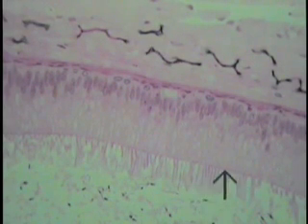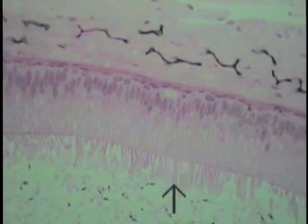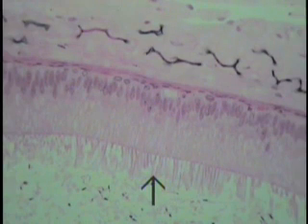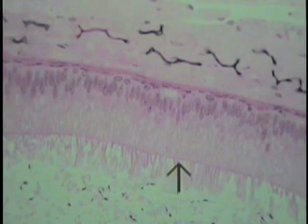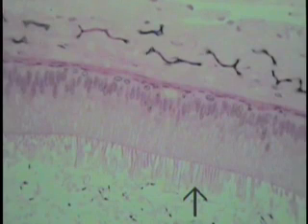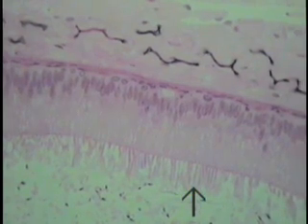These are oftentimes clumped together and form these wisps coming out from the apices of the cells. These are the so-called stereocilia. A highly branched form of microvillus, not true cilia, they do not beat, but are increased surface area once again for absorptive capacity, but have been given the name stereocilia. Look at these structures at increased magnification.